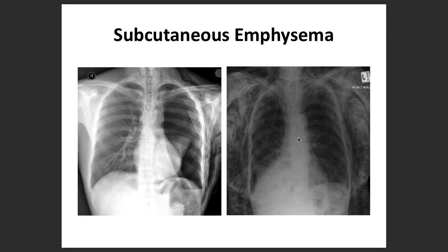Mostly we should focus on the cardiological aspects, of course, when we are getting trained for cardiology. However, we all are physicians first, because you can always see those pulmonary vessels as well, those pulmonary pathologies. You will be able to notice. So at least you're not expected to be like a radiologist, trying to identify each and everything, but at least identify the basic things on which you can modify or initiate your therapy, or the emergency conditions at least.